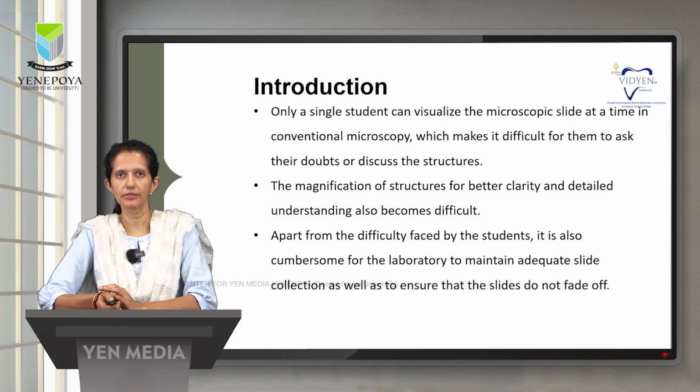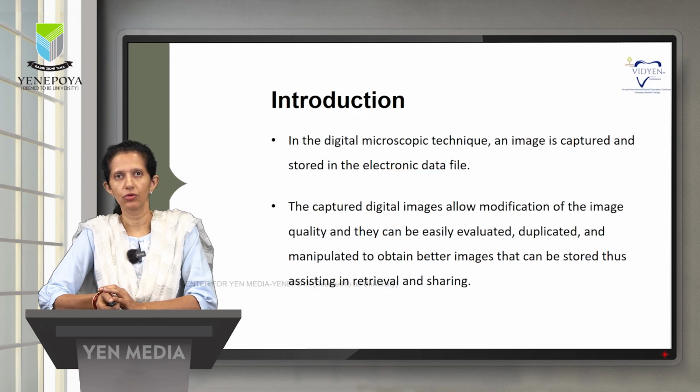The magnification of the structures for better clarity and detailed understanding also becomes difficult. Apart from the difficulty faced by the students, it is also cumbersome for the laboratory to maintain an adequate slide collection as well as to ensure that the slides do not fade off. In the digital microscopic technique, an image is captured and stored in an electronic data file. The captured digital images allow modification of the image quality, and they can be easily evaluated, duplicated and manipulated to obtain better images that can be stored, thus assisting in retrieval and sharing.